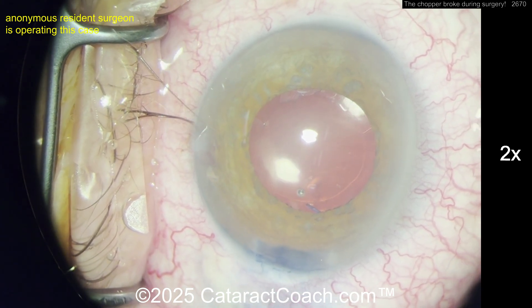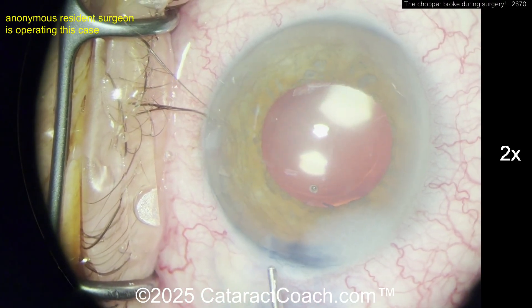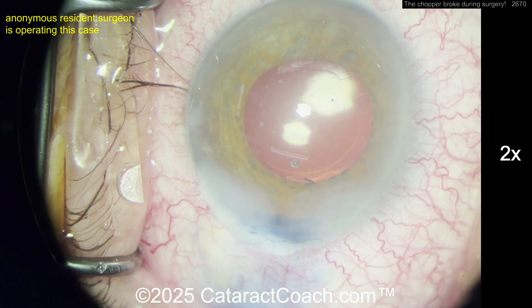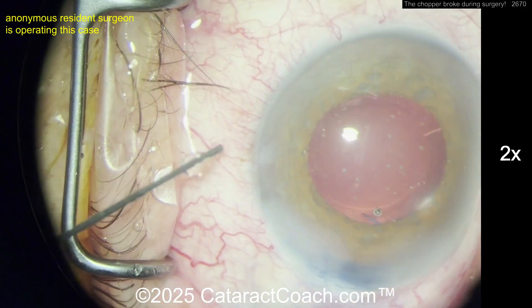End of the case — the bleeding has subsided, so just seal up the incision and I think you'll be fine. Again, this can happen. The important thing is to really make sure you get those pieces out — viscoelastic is your friend here. You can encapsulate and trap that fragment.